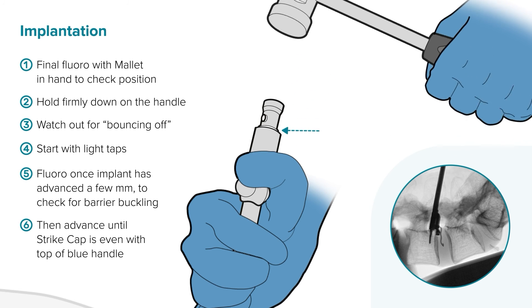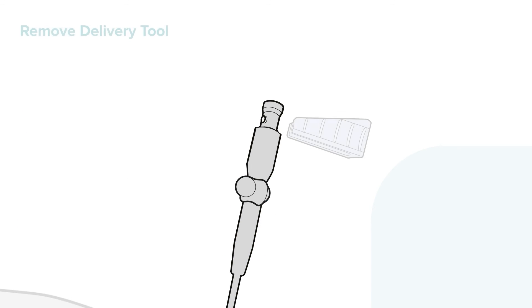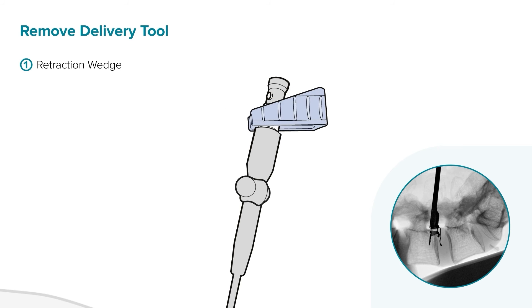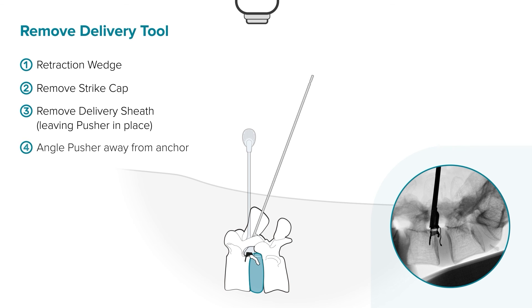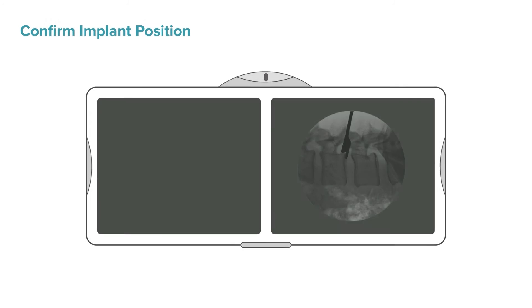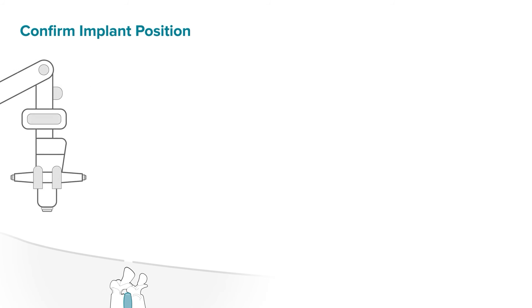Start deployment with periodic fluoroscopy checks to make sure the occlusion component is advancing into the nucleus and the delivery tool is seated against the back of the vertebral body. Once confirmed, keep tapping with the mallet until the ridge of the strike cap aligns with the top of the blue sheath — take lighter taps as you get closer. Remember, this is a visual stop, not a mechanical stop. Take a fluoroscopy image to confirm that the anchor is appropriately countersunk into the vertebra. Use the retraction wedge to separate the pusher from the implant within the delivery tool, angling it like a bottle opener for further separation. Then press the button and remove the strike cap, then remove the blue delivery sheath, and finally remove the pusher by tipping it toward the disc space and lifting it up while carefully visualizing the neural elements. Confirm the implant position on fluoroscopy and ensure visually and by feel that the anchor is countersunk into the bone.